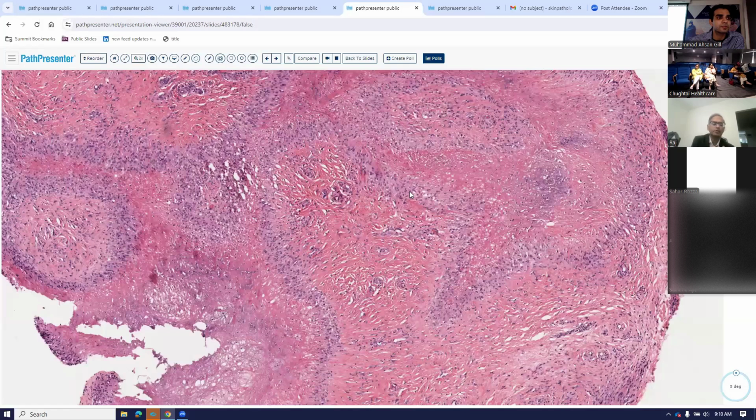So in palisaded granulomatous dermatitis, there are a couple of conditions that you should always think about. One was granuloma annulare, where you saw the necrobiotic collagen and increased mucin. One is this rheumatoid nodule, where you see this fibrinoid degenerated collagen surrounded by the palisade.